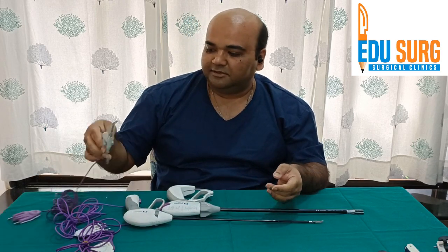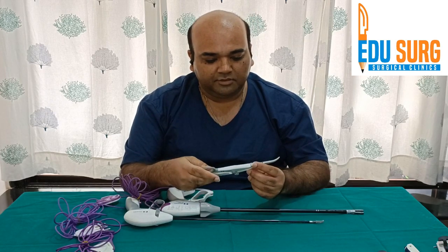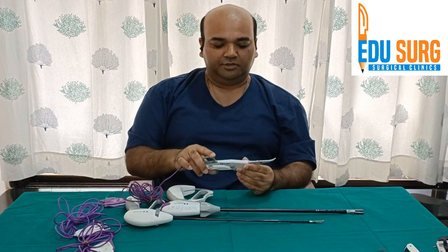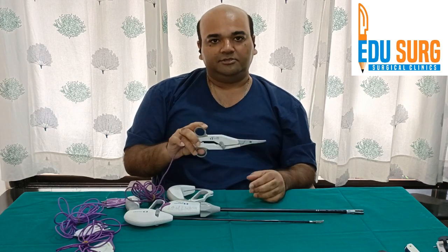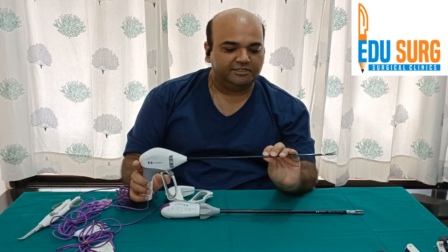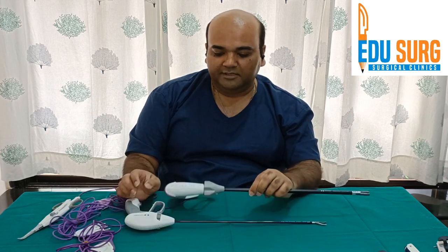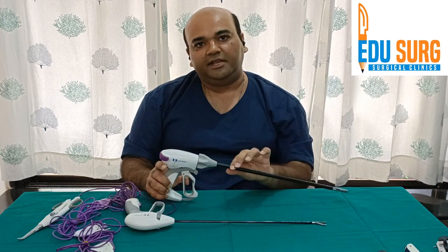We routinely use LigaSure Impact and LigaSure Mini in open surgery — these are the two smaller devices. LigaSure Impact is larger, and LigaSure Mini is smaller than that. Then you have LigaSure Maryland, which is 5 mm with a Maryland tip. And this is the 10 mm LigaSure Atlas, which goes through the 10 mm port.